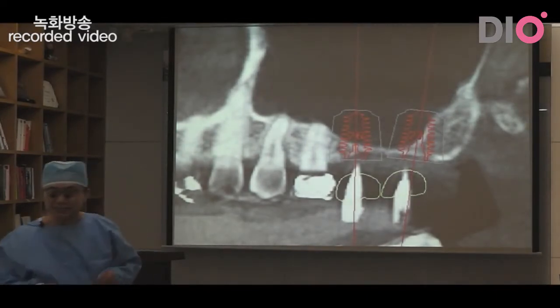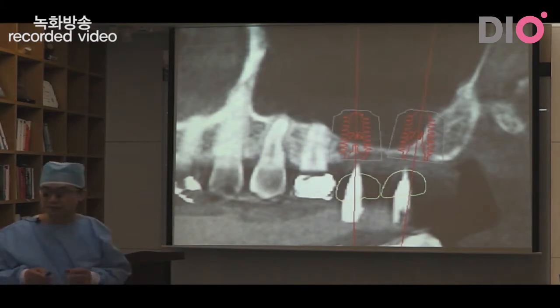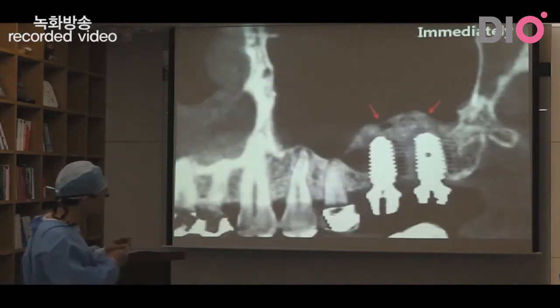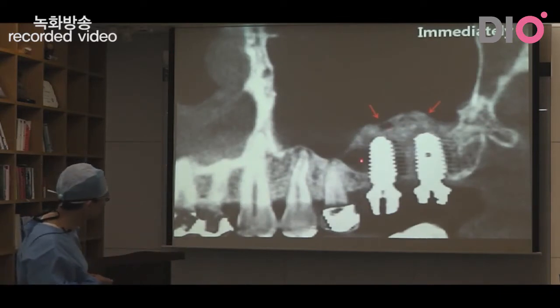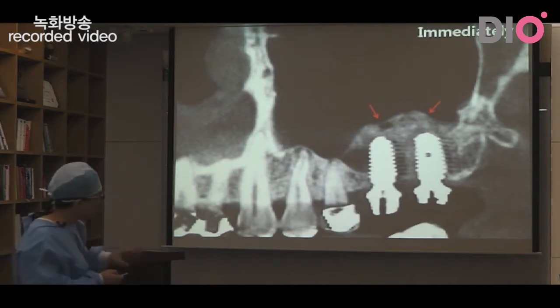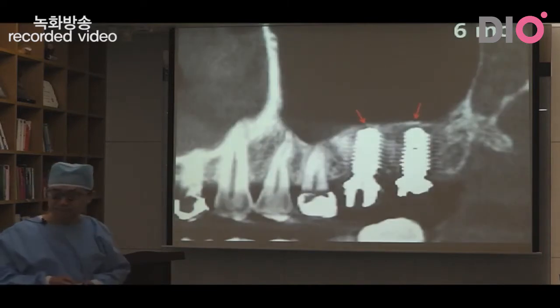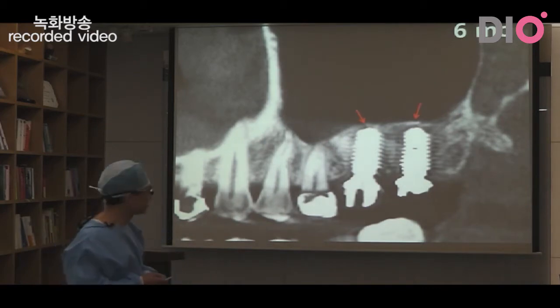Let me show you how they heal after the grafting procedure. This is before the procedure, before surgery. You can see here, very thin bone below the sinus floor. It's about 1 millimeter bone thickness. This is immediately after the procedure. You can see here the space between the collagen sponges. 6 months after procedure, you can see the increased radiopacity in the graft site.